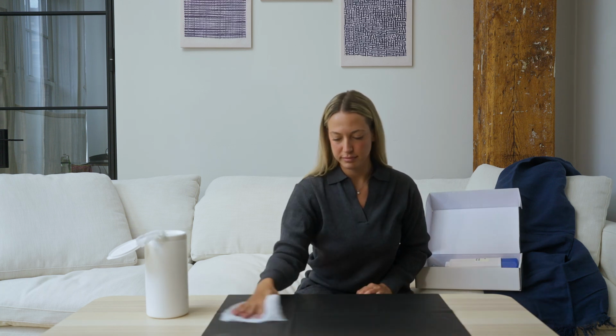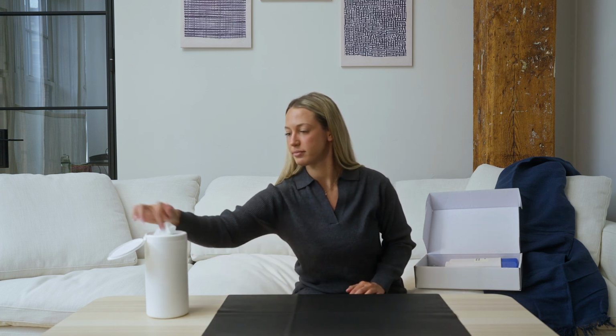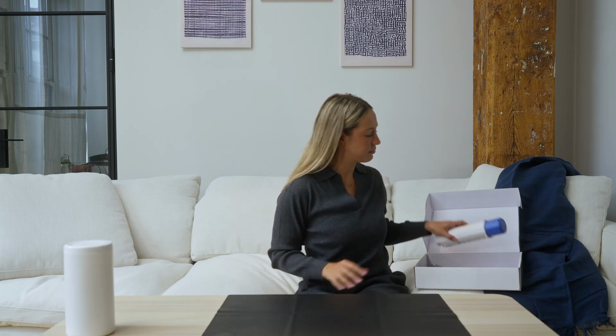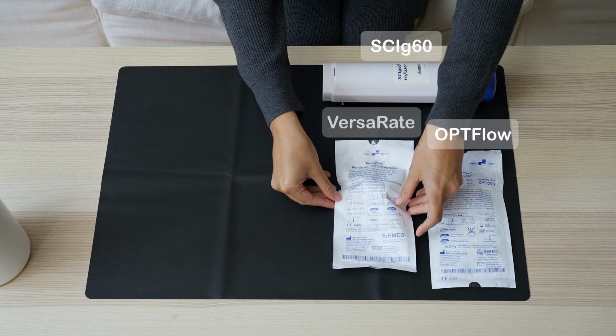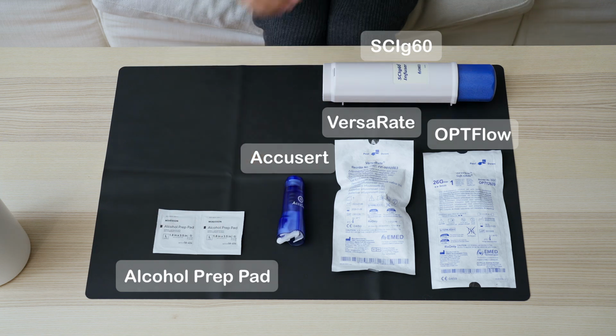If using a pre-filled syringe, you will skip this next step. For drugs supplied in vials, transfer indicated fluid from the vials to the syringe according to the product labeling or as instructed by your healthcare professional. You will not want to draw fluid into the syringe until it is time for use.